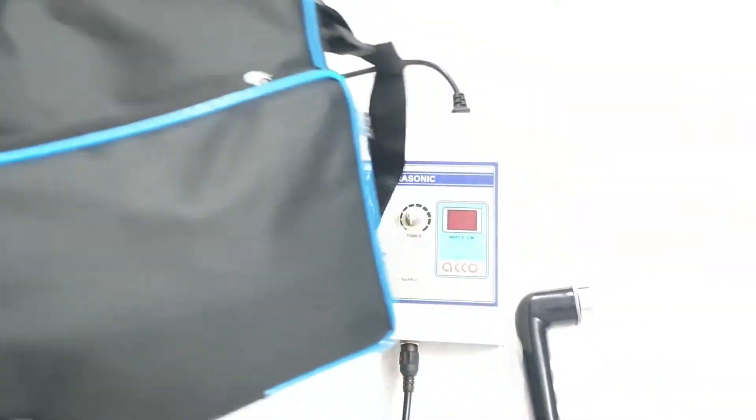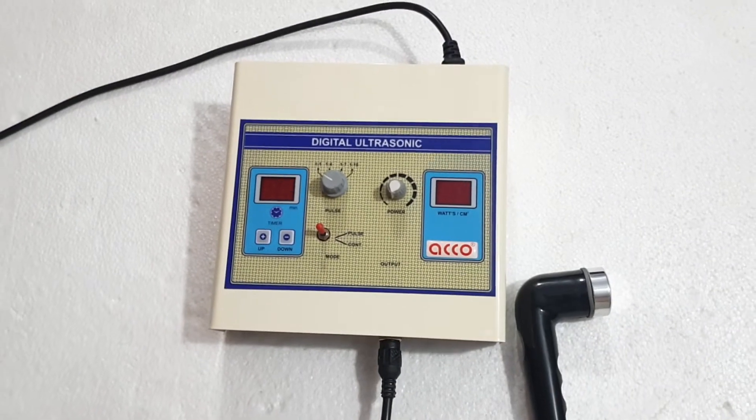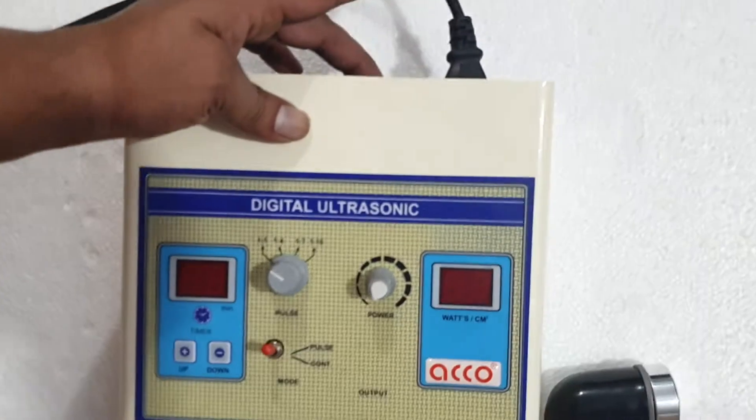This machine comes in a carry bag with complete accessories. Let's start the demo now. Switch on the machine.